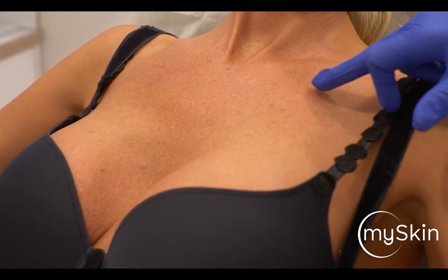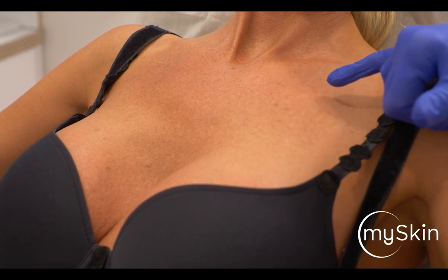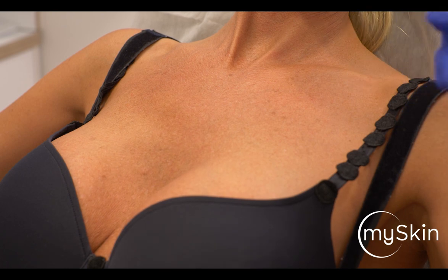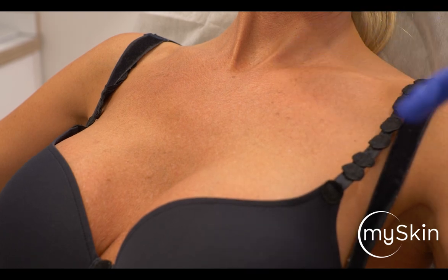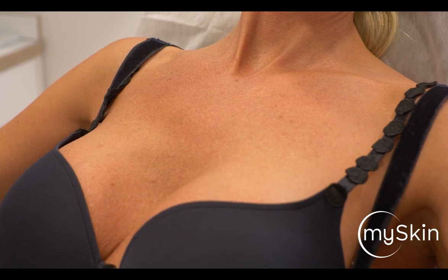We see on her chest the age spots — the lentigos solaris — which is due to chronic sun exposure. We also see some vascular components, which make the skin appear a little bit blotchy, a little bit reddish, a little bit brown. And this is something we would like to improve.